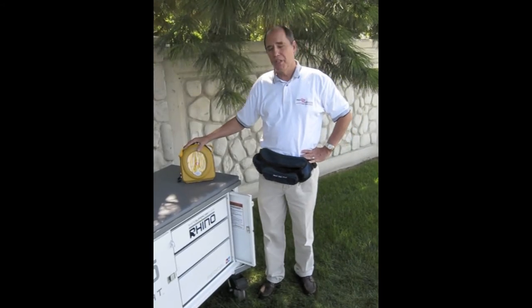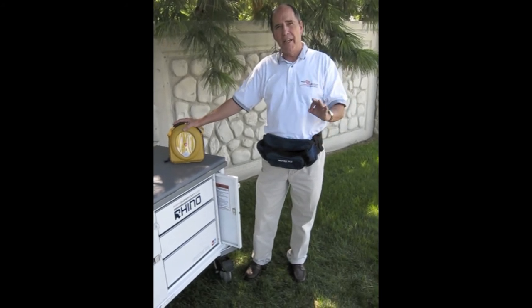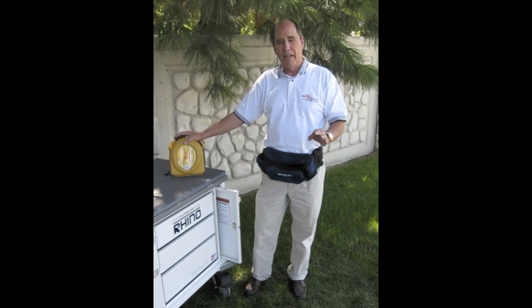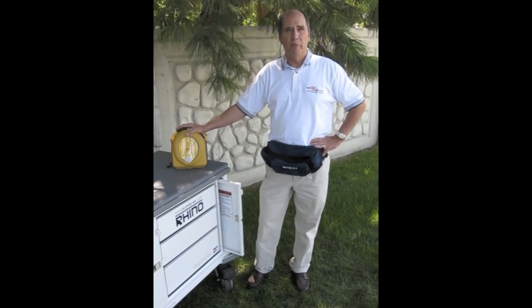The HeartSign Samaritan AED comes with a 10-year warranty, a 4-year battery and pad pack, and has the highest drop test ratings in the industry. It's available now at a great price when bundled with the Rhino Super Cart. Please talk to your sales representative for more information.